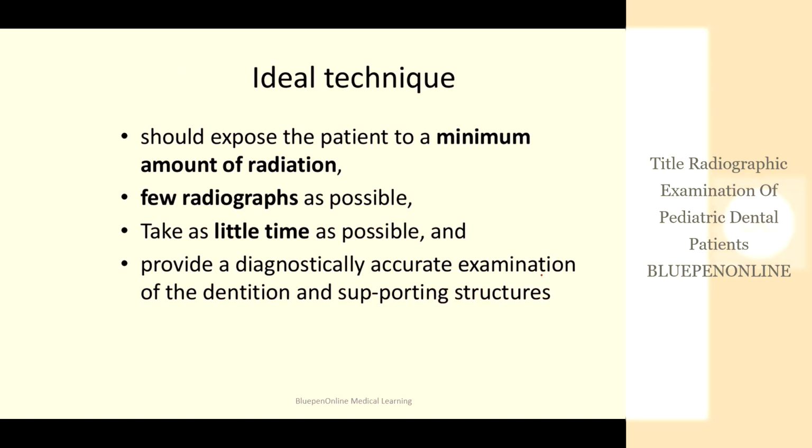The ideal method is to expose the patient to a minimum amount of radiation, take as few radiographs as possible, take as little time as possible, and provide a diagnostically accurate examination of the dentition and the supporting structures.